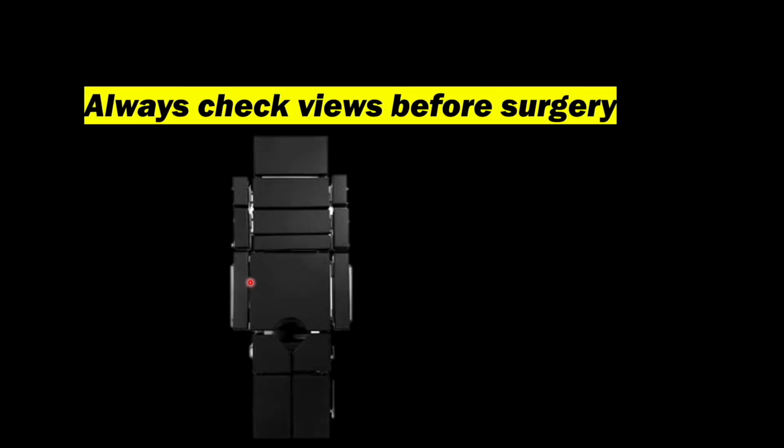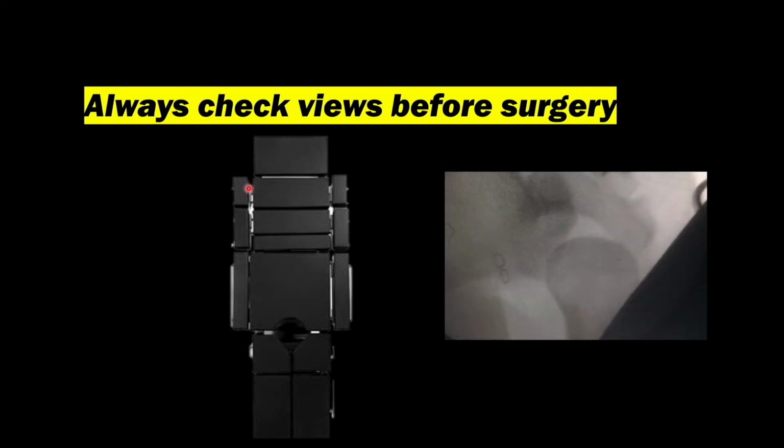Now before proceeding towards the surgery, we always need to ensure that the fluoroscopy console is positioned adequately. Why? Because often our operating tables have metallic edges in this area, and these edges are going to obscure your view. So the position of the patient needs to be adjusted according to these metallic edges, as we'll be seeing in the coming slides. For example, in this image, the metal is obscuring the view of the proximal humerus. So the patient either needs to be shifted to the outside area or toward the inside area, which is radiolucent. These things should be kept in mind before proceeding to the surgery.